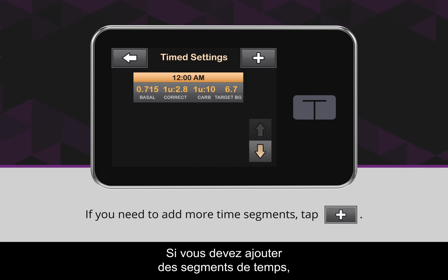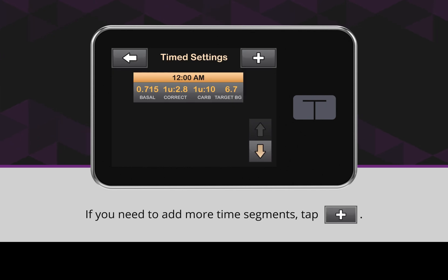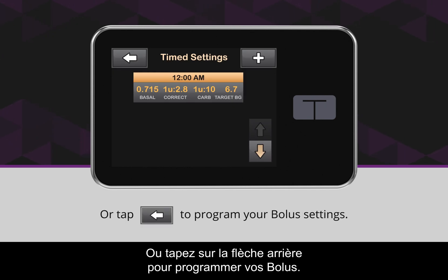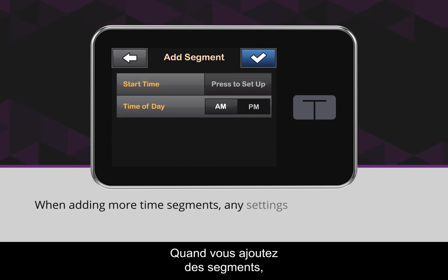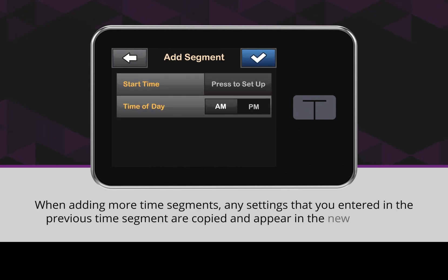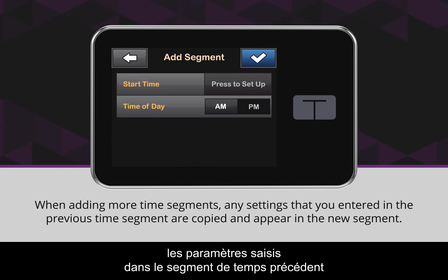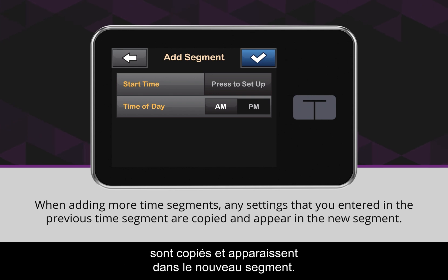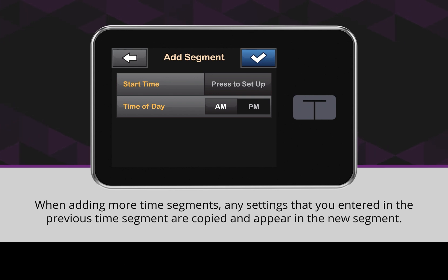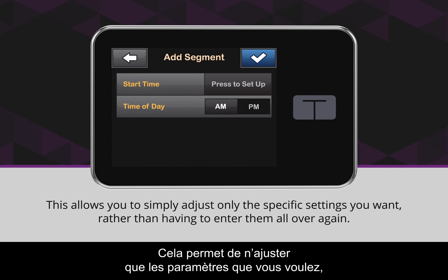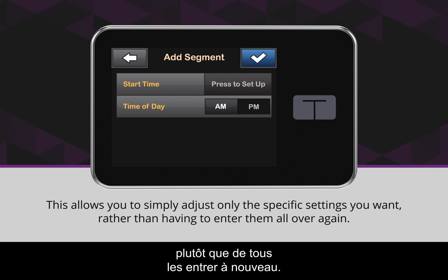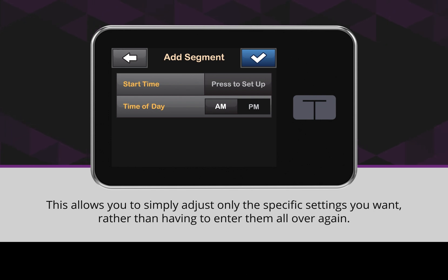If you need to add more time segments, tap the plus icon, or tap the back arrow icon to program your bolus settings. When adding more time segments, any settings that you entered in the previous time segment are copied and appear in the new segment. This allows you to simply adjust only the specific settings you want rather than having to enter them all over again.